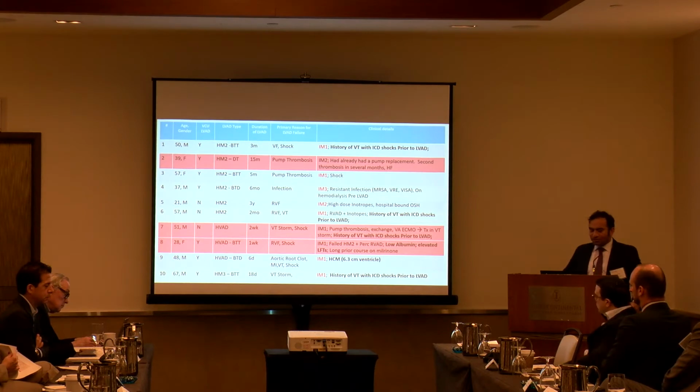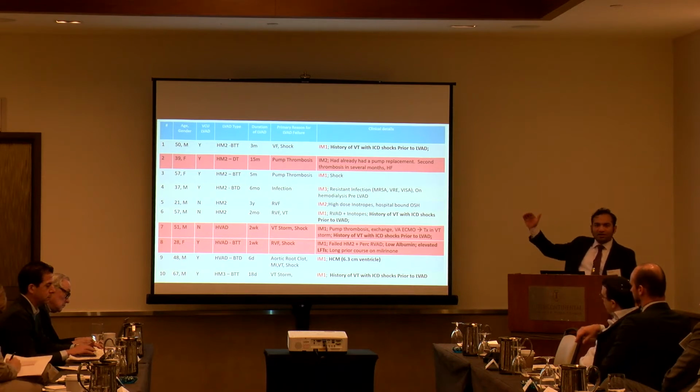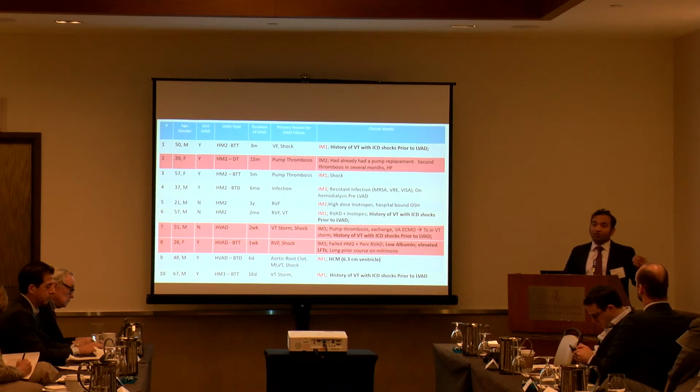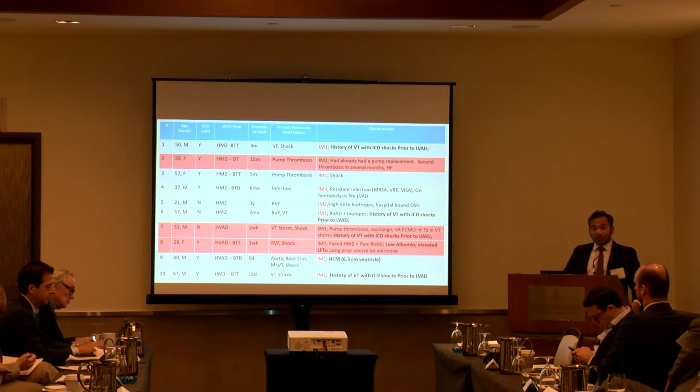Now I want to walk through this table, and I couldn't figure out a clearer way to convey this information, so I created a complex table. We'll start at the right side, and to give you a sense of eras, since this spans probably 12 years of experience, it is from the earliest implant to the most recent, from top to bottom. Patients were generally primary LVAD implants at VCU, but 3 of the 10 were imported urgent LVADs from nearby device implanting centers. So about 2 out of 3 were our own LVAD patients, and 1 out of 3 were referred by other LVAD or transplant centers. The rows highlighted in red are patients who did not survive to transplant, and we'll examine why, and the blue are the ones that did.